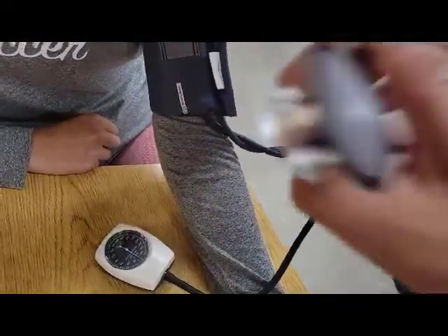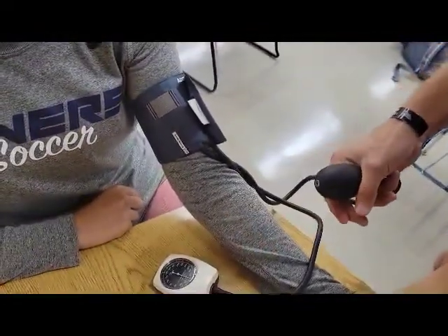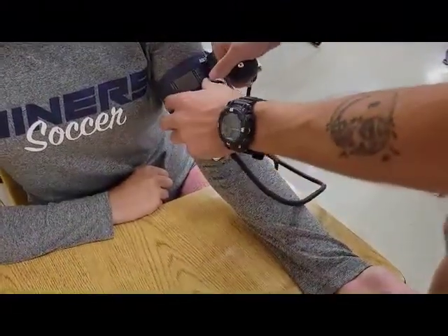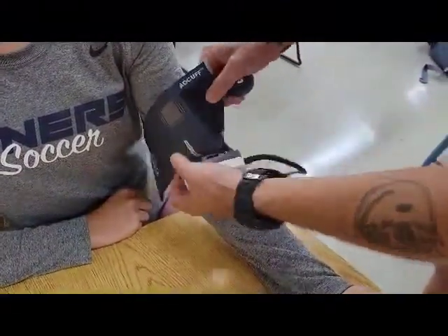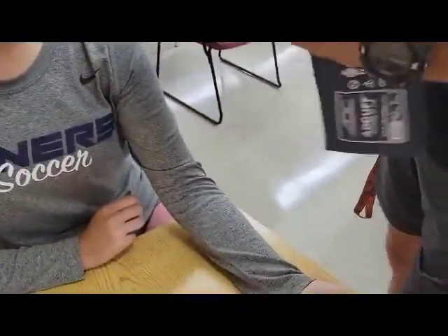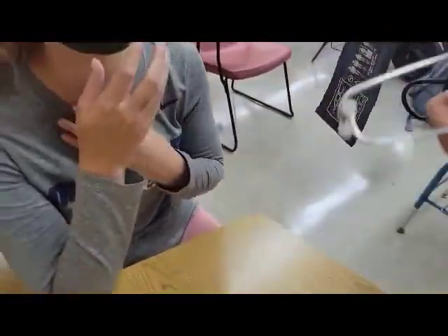So what you're listening for is the first sound, which is the systolic blood pressure, and then the last sound that you hear is the diastolic. And on Christina, correct? I got 124 over 76. Good.